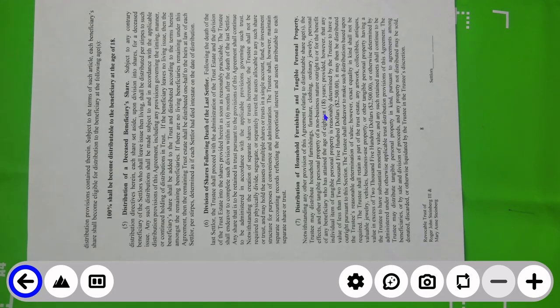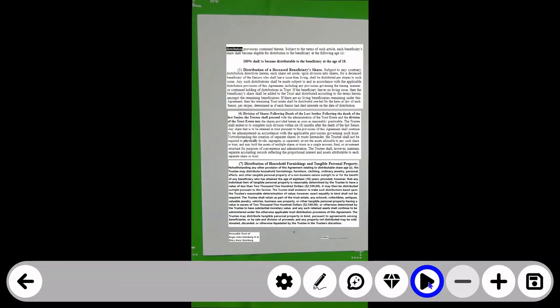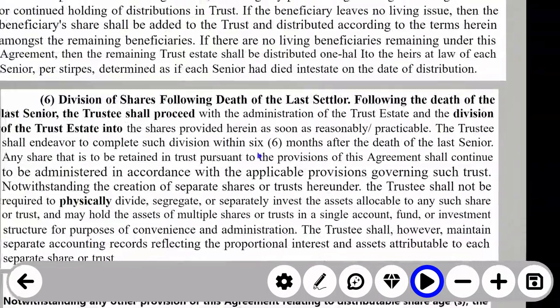As you can see, I have a simple legal document underneath as an example today. And what I'm going to do is go ahead and just capture this using the camera in the lower right group of icons, and I'll capture the page. I have my system set to do optical character recognition and allow me to use text-to-speech on this. So now that it has been captured, I can zoom in, I can click and drag on the screen.